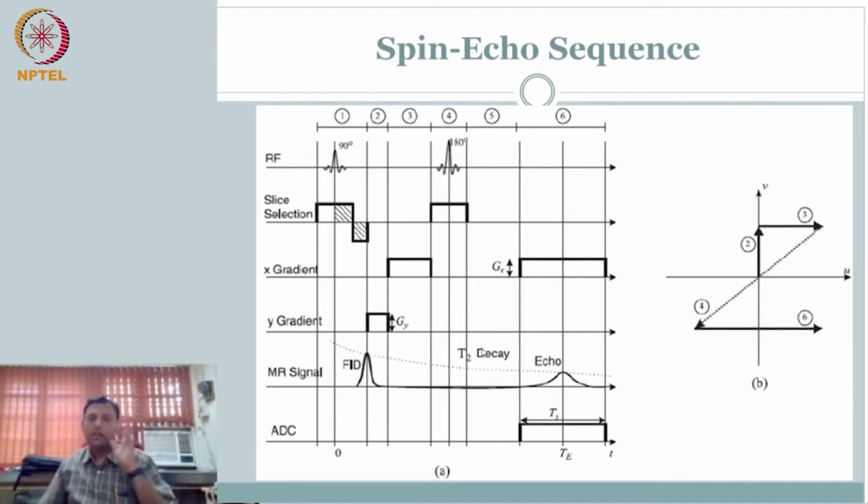That is the difference. So how do we look at this in the diagram in uv? I started applying the signal, but I am not measuring it. So step 2 allowed me to do phase encoding, meaning moving in the y direction. Once I moved there, in step 3 I should have had signal, right? But I am not measuring the signal. So in 3 it is regular, it is doing signal, but I am not measuring it yet. At 4 I am applying a 180-degree pulse, meaning I am flipping. So when I flip u and v, it will come here. So essentially I am at this location.